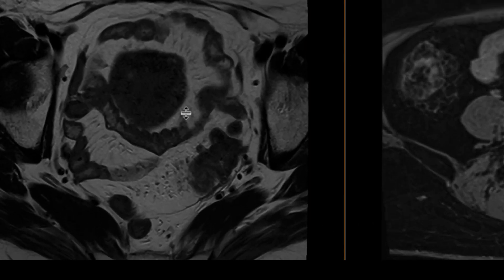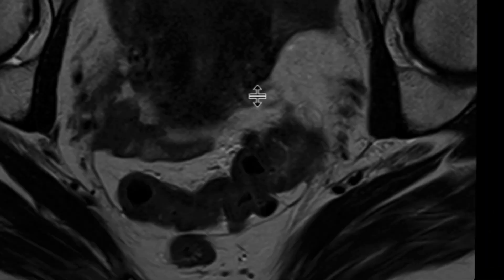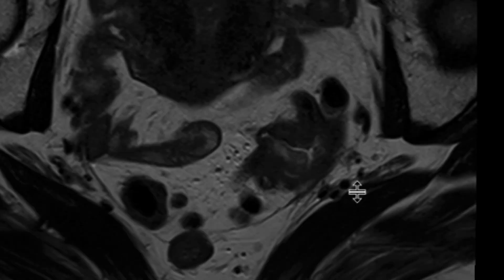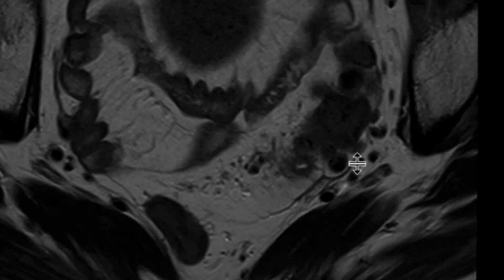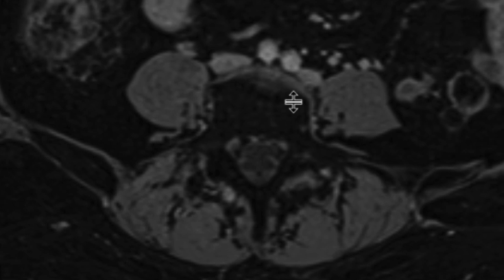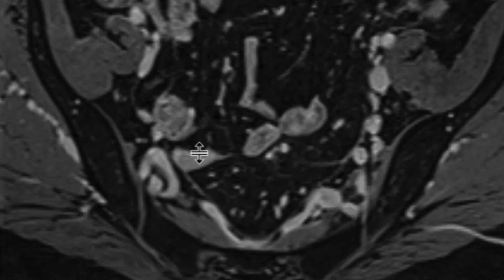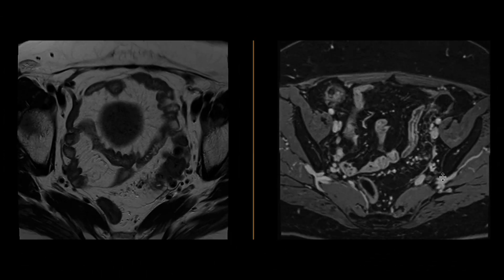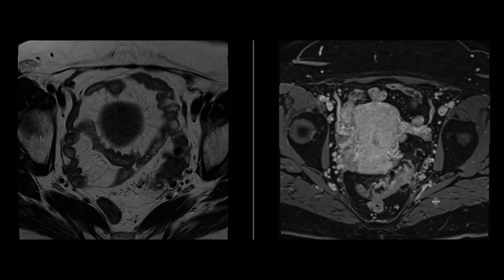Let's focus on the sigmoid colon. There's a bunch of diverticula, and specifically in this location there is bowel wall thickening, a little bit of edema as well. Look at this loop of sigmoid colon with this diverticula — that's inflamed. There's a little bit of fluid inside of it as well. On the post-contrast sequence, we can see that focal area is hyper-enhanced. You can see some of the adjacent peritoneal lining is also inflamed with reactive inflammation, and so these findings are compatible with sigmoid diverticulitis.